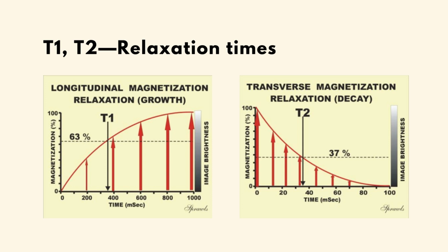When the RF pulse is turned off, the protons are again influenced by the external magnetic field B0 and return to the direction of B0, meaning they return to a lower energy level. But the protons do not return to the B0 direction at the same time; they change direction gradually and consecutively after the RF pulse is turned off, so the longitudinal magnetization component increases again to M0, and the process is called relaxation time.